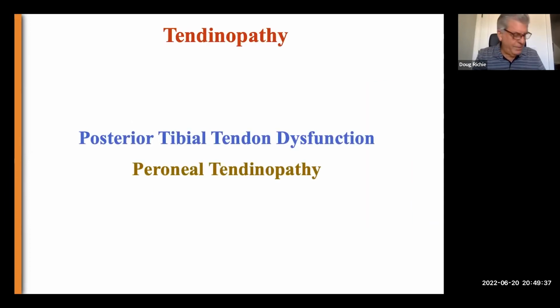Okay. I'm just going to finish with tendinopathy because MSK podiatrists treat a lot of tendinopathy. And while the buzzword today is doing gradual loading and load management and rehab and gradual strengthening, I still know, having treated thousands of patients with tendinopathy, that during the initial stage of the rehabilitation process, particularly if there's a documented tear of the tendon, you have to offload and protect the tendon while allowing full range of motion and allowing the rehabilitation process to take place with load management and hopefully eventually getting rid of the brace.